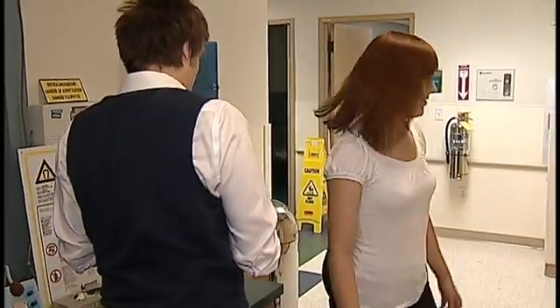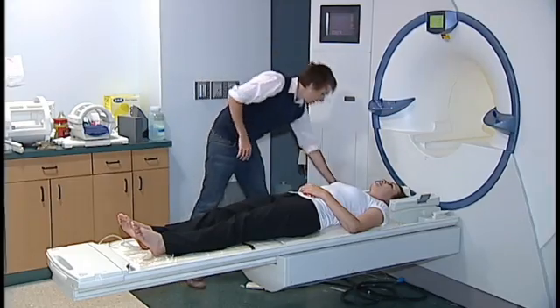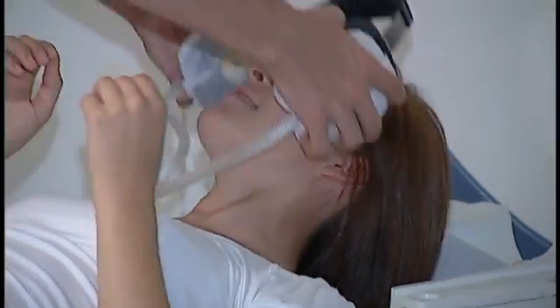A metal detector is used to check that participants have emptied their pockets of dangerous items. It is important that the participant is as comfortable as possible on the scanner bed, as any discomfort may cause them to move during the scan.